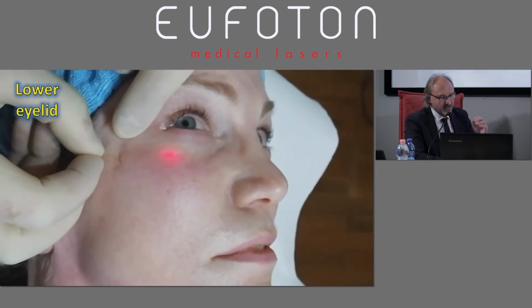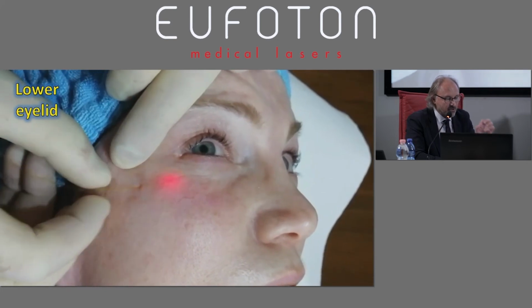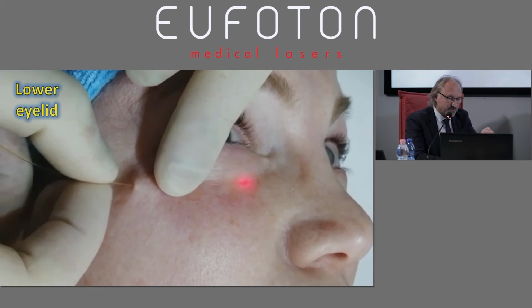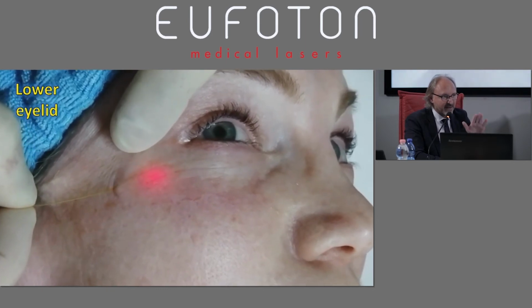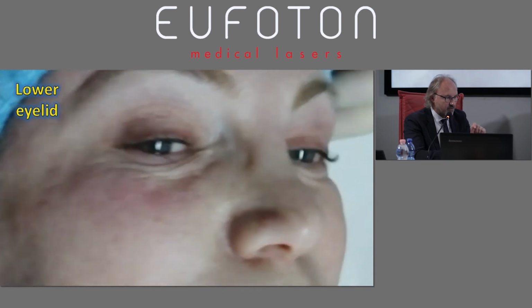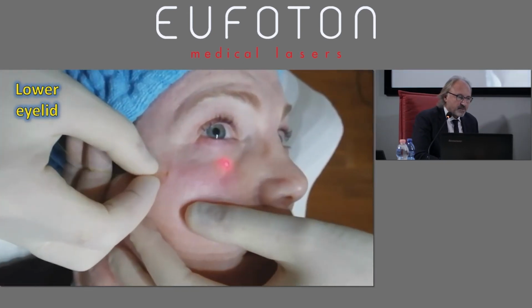I don't like to go into such a sensitive region with the laser light. I prefer to make use of my hand to overcome harder points, and then I go inside more slowly, retrograde, and also pulse with the pedal, 3 or 4 pulses, and then I retract.